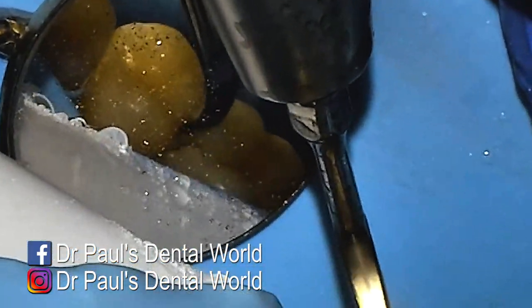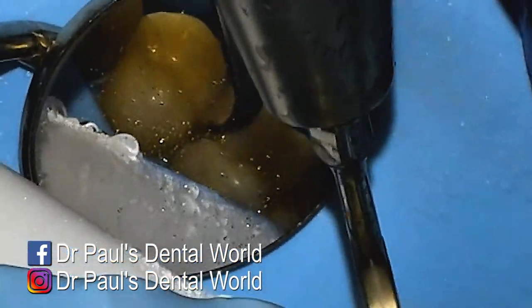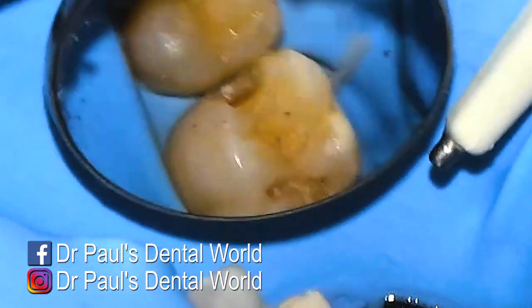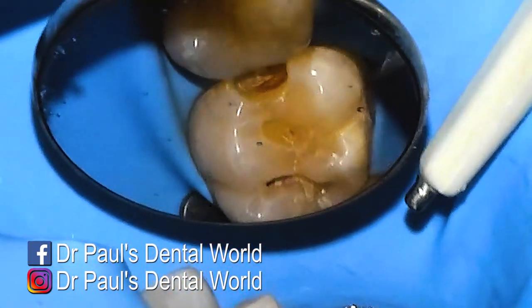I can see a little bit of that white chalky enamel on the outside surface of the tooth, so I'm going at it again with my ultrasonic. You can see here that the contact has been broken and it's all looking really good.